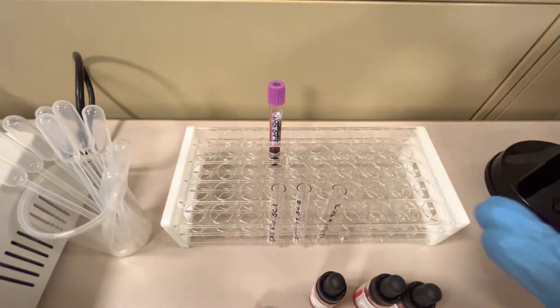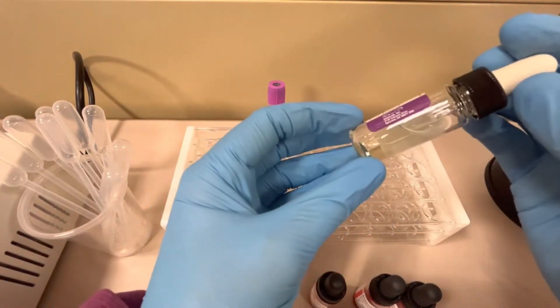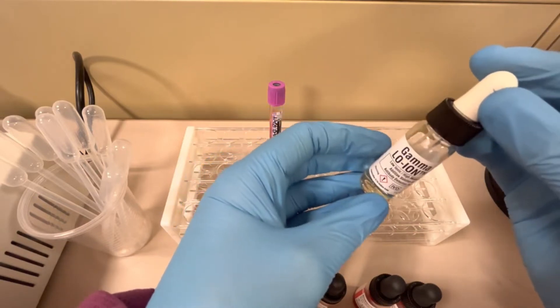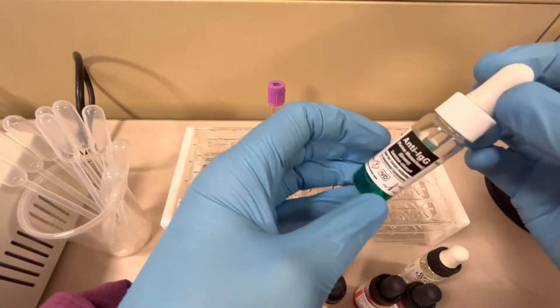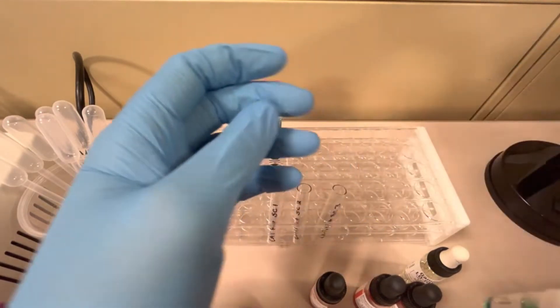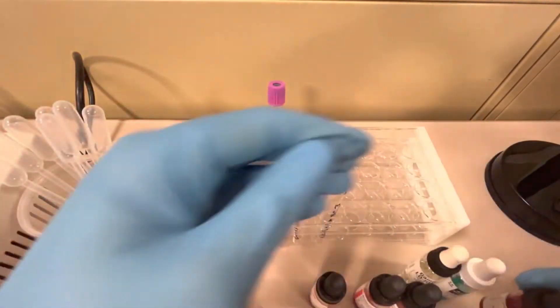You'll also need a potentiator — I'm using low ionic strength saline, or LISS. This encourages any antibodies present to react in the tubes. We also need an AHG reagent; I'm using a monospecific anti-IgG for this particular test. And finally, we need check cells for the end of the procedure. Those are all the reagents we need.